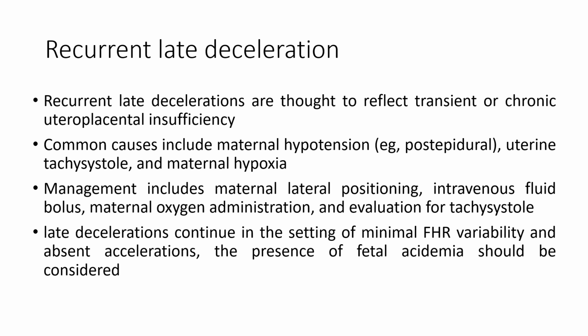Recurrent late deceleration. So the recurrent late deceleration reflects transient or chronic uteroplacental insufficiency. Most common causes can be maternal hypotension, especially after epidural anesthesia, uterine tachysystole caused by excessive oxytocin or administration of prostaglandins like Cytotec, and maternal hypoxia.